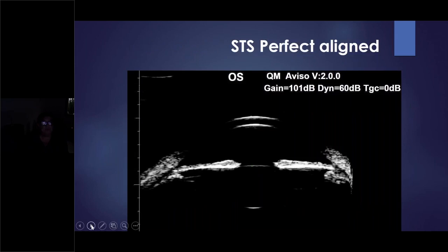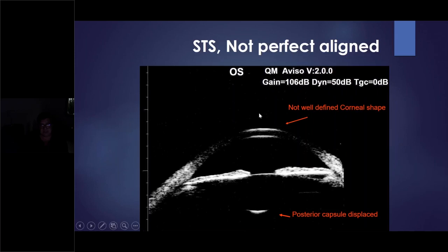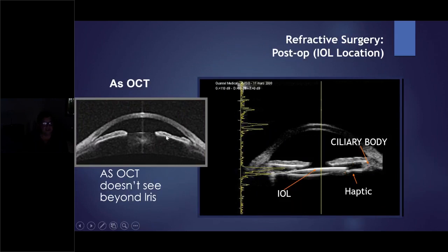Okay, let's go. If all the surfaces are perfectly aligned, you can measure sulcus to sulcus, no problem. If you see that there is no correlation between the cornea, anterior capsule, and the posterior capsule is displaced, please do not measure the sulcus to sulcus distance, it's not correct. With anterior segment OCT, you can't see beyond the iris. If you want to know the post-operative IOL location in refractive surgery, you must use UBM.